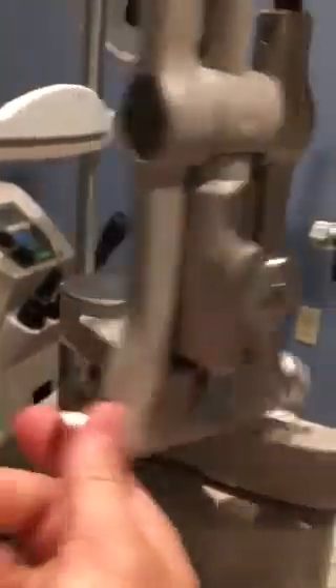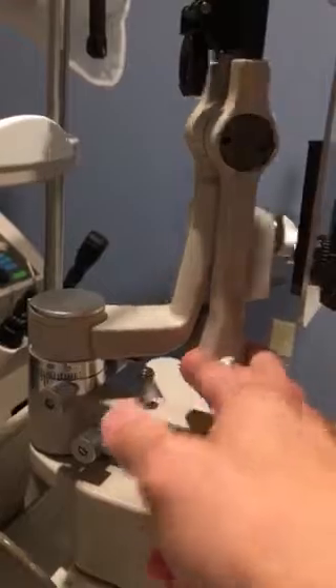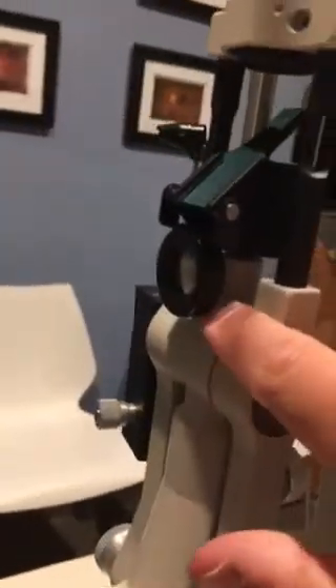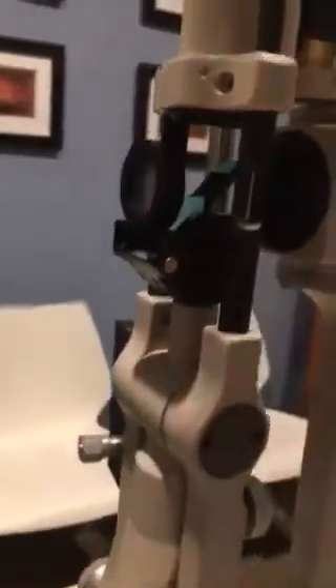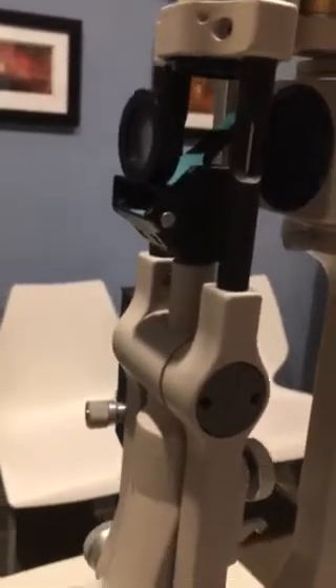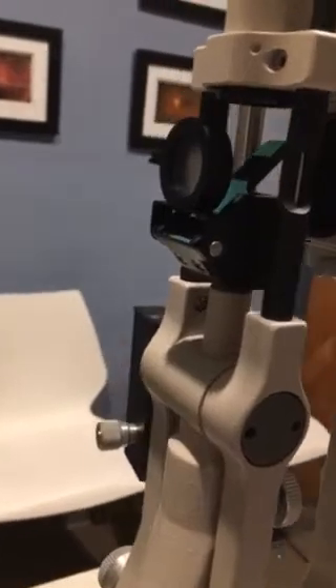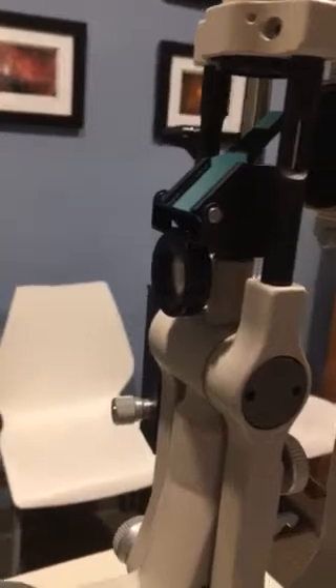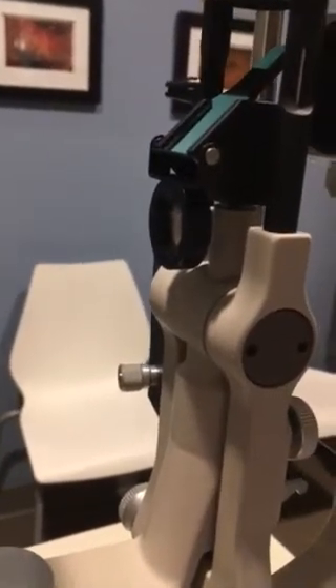I can also change the thickness of the beam by turning this knob here on the side. This is a handy dandy knob because I can turn the lamp forwards and to the side so I can get better views as I need. If I want to just do a washed-out view — no beam whatsoever — some slit lamps will have this diffuser that I can flip up on the mirror, and that'll just give me a nice, broad, white light for gross assessment of the adnexa and ocular structures. Flip down, and we're dealing with our slit — our tiny beam of light looking at the eye as needed.